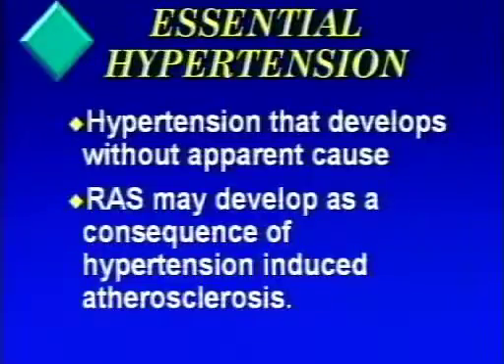And secondly, patients that are treated medically for renovascular hypertension have an increased incidence of renal failure and much shorter lifespans. So if we can non-invasively detect and repair a renal artery stenosis in patients who have renal vascular hypertension, we can significantly minimize the complications that are associated with these patients who have been treated medically for this condition.